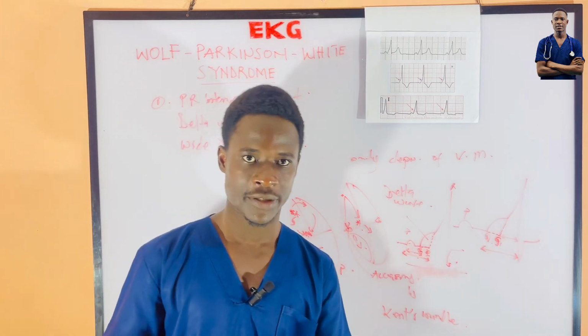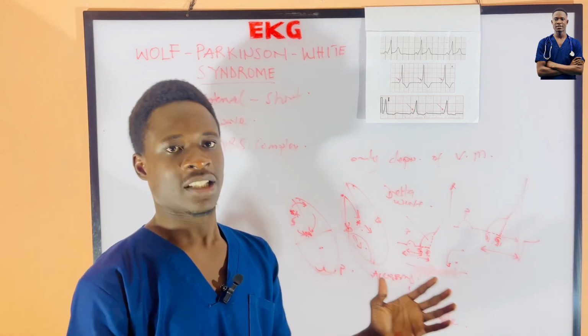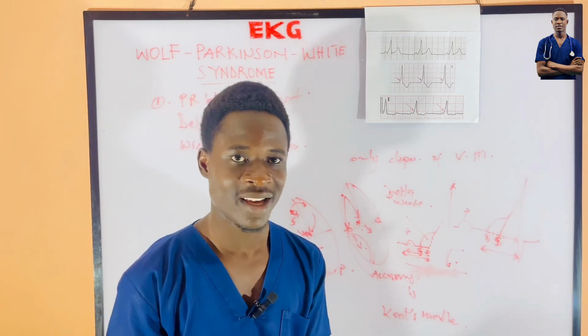You see, it's very interesting. That's the reason why I said earlier on, when I was starting the video, that we will be talking about an interesting topic, and this is it.